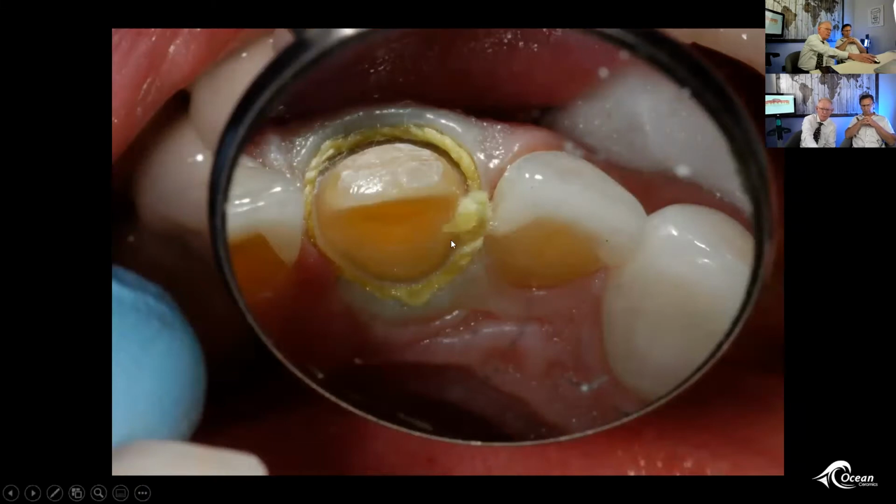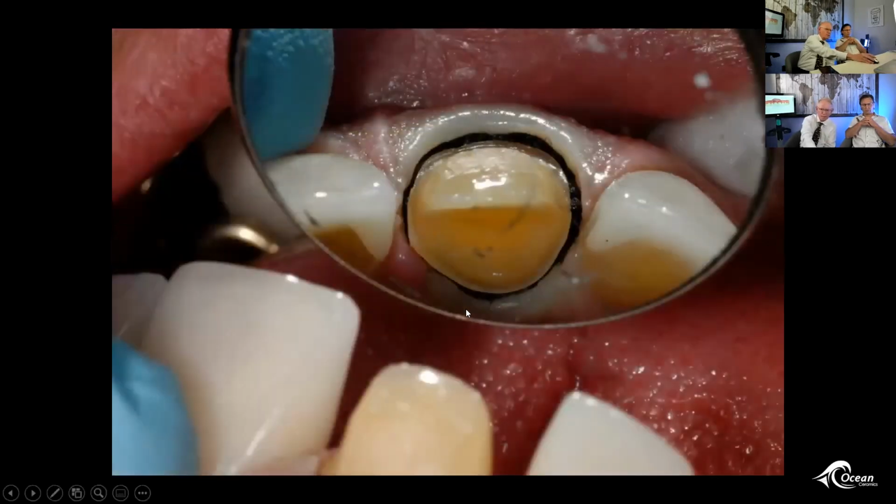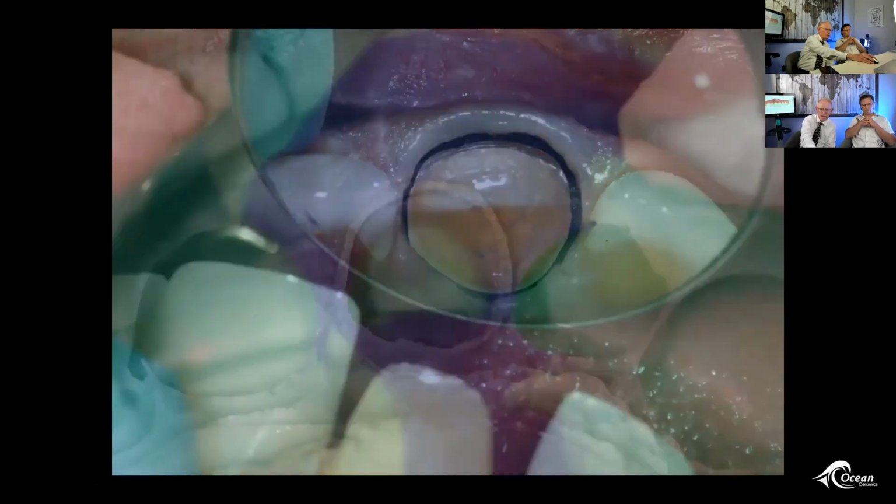If you see the straight line across here, it's about equidistant from here to here. This is a proper amount of reduction on the incisal and on the facial that gives us the chance of getting the crown exactly in the right position with the proper thickness of porcelain. There's a second cord that goes on top, and then we snap the impression.